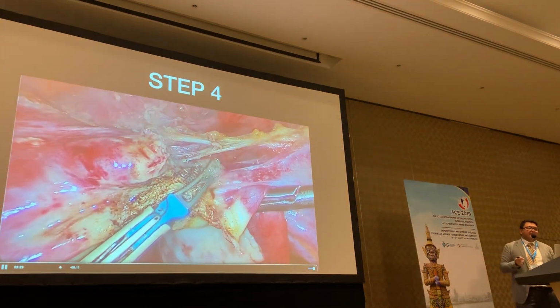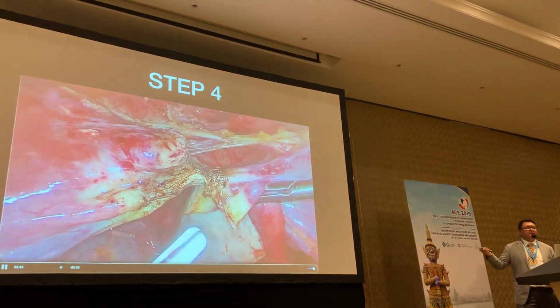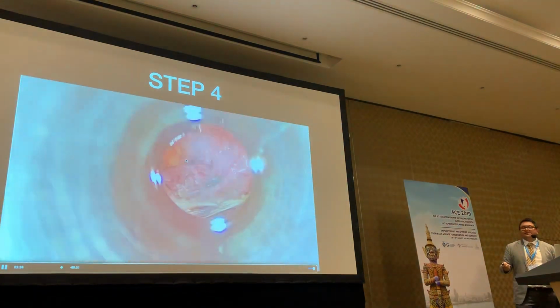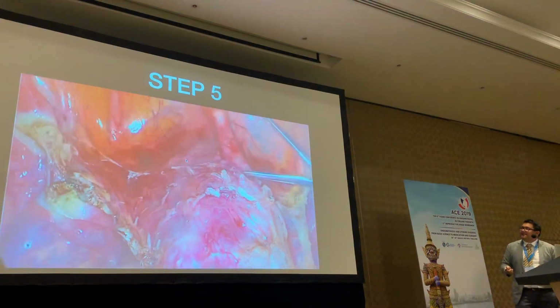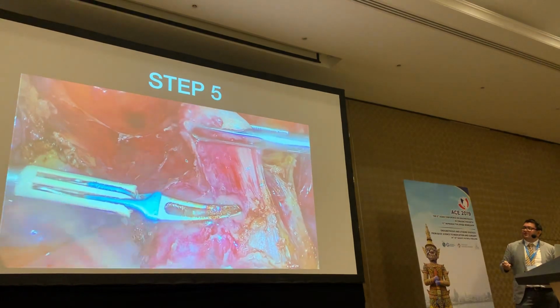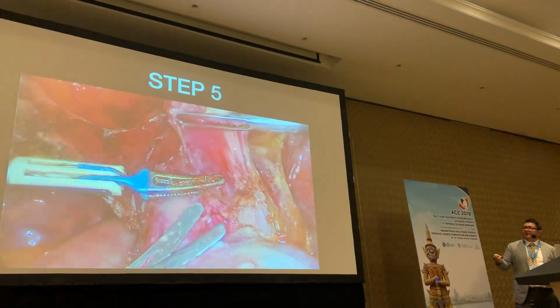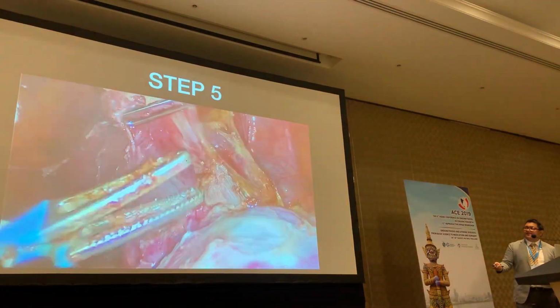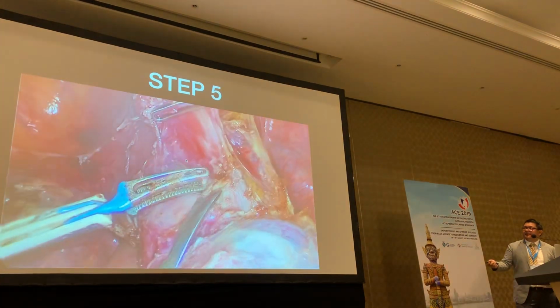If you cut more than you coagulate, you're going to have a bleeding which retracts, and you're going to waste even more time suctioning and catching that bleeder. So prudency is key. Now, coming to the bladder dissection, once you've cut the peritoneum, you will approach what you do with vaginal hysterectomy as described by Professor Shirish, and you can appreciate it better, which is right above the uterine. You can open and you see the pearly white cervical tissue, and the adhesions are highest in the midline.